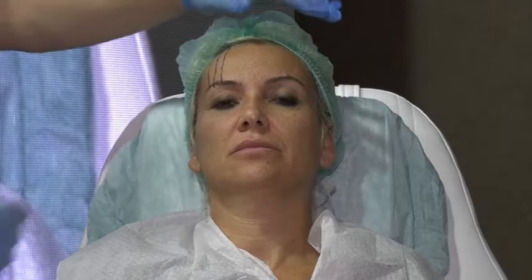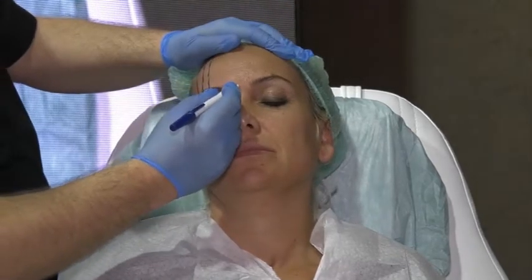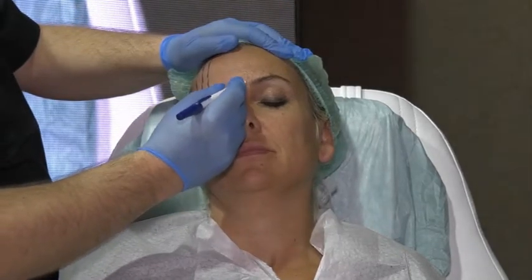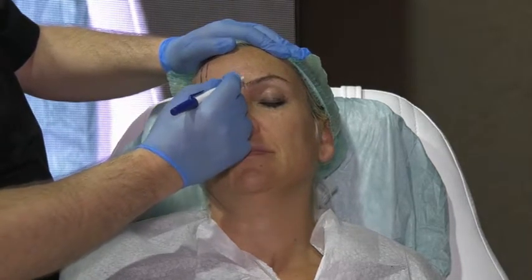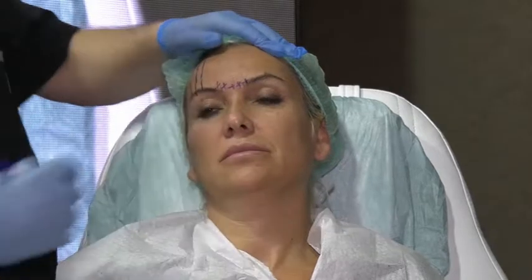Look here. This is the center exactly. I put one. 1 centimeter medial, I put one. 1 centimeter here, I put one. At the beginning of the eyebrow, I put one. Here, I put one. I put in this area, guys, 5-6 CD threads. Okay? The patient was about to dance in the clinic. She was, by the way, from a royal family.